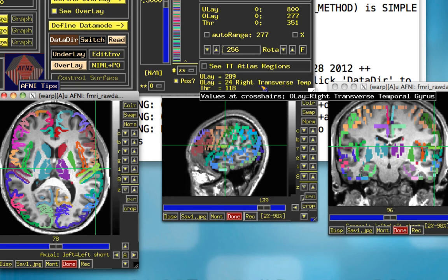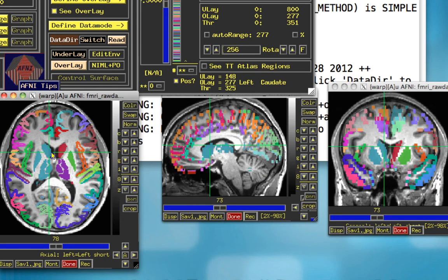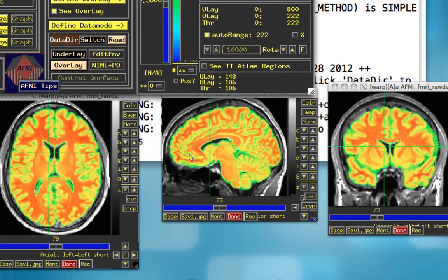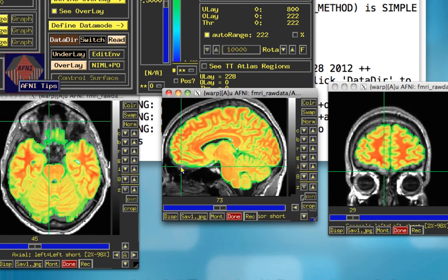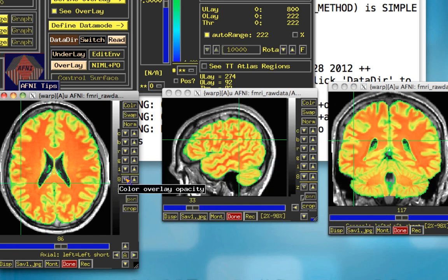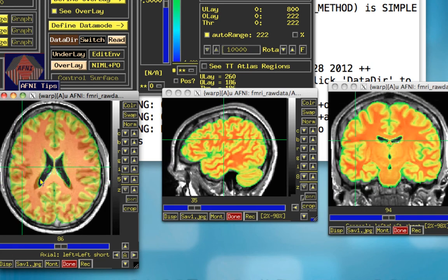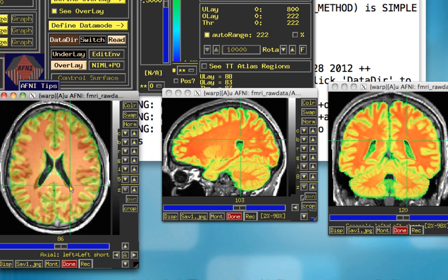You can also see the atlas specifying what you are clicked on — right insula, left anterior cingulate, left caudate, things like that. With another Talairach template overlaid, you can check the alignment between your Talairach-warped brain and the actual Talairach template. You can see it's an okay fit, though some of the brain may be outside the template space. We're mainly concerned with interior structures. You can decrease the opacity of the overlay and try to make sure the sulci and gyri are roughly aligned and the edges of the ventricles are about where they should be. The automatic Talairach function in AFNI usually does a better job.